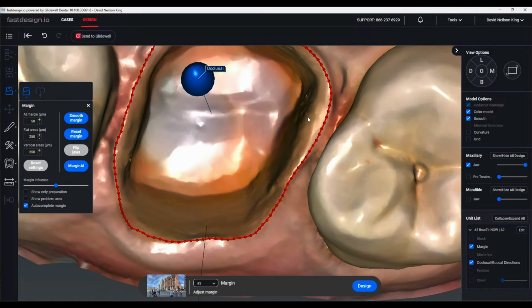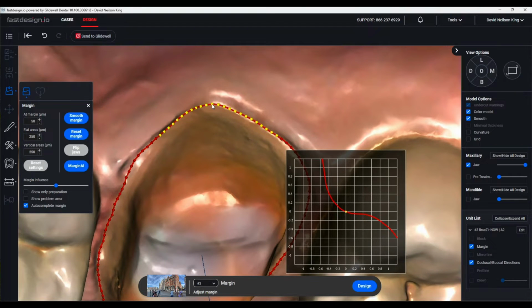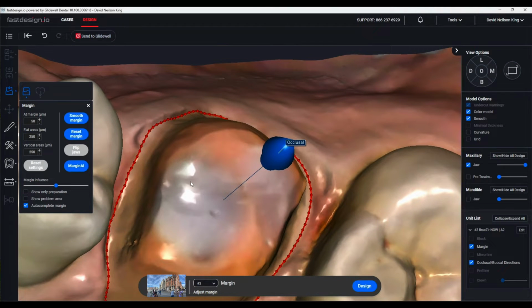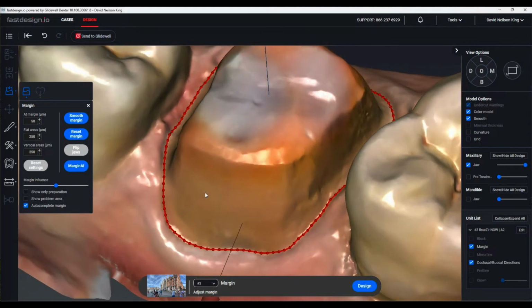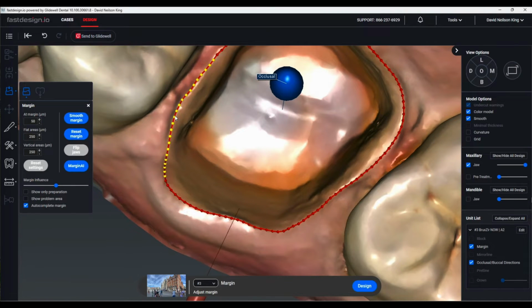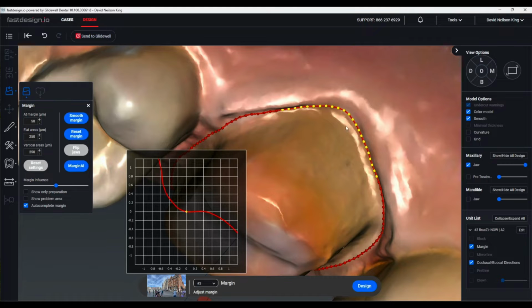Since I prepped the tooth, usually the doc, or the person who prepped the tooth I should say, is the best person to actually outline the margin. Sometimes, even with a high resolution scanner like we have, we'll end up with a little bit of difficulty getting a clear margin. So yes, use some cord if you like to get a nice clear margin. Also, you can use a laser or electrosurge. I find just using a little viscostat, making sure the margin's nice and dry, tends to solve the issues for me most of the time.